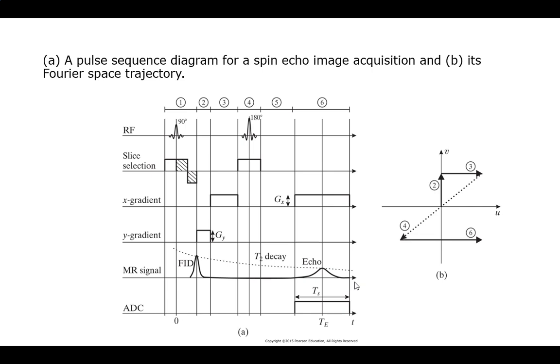So instead of taking advantage of this, I'm now going to position myself so I can do my echo measurement. I perturb Y in the opposite direction I want to go. So it goes up because I want to go down. And then I perturb X, so I am now in the complete 180 opposite through the center. I need that mirror through the center symmetry. It is now set up, right, at this point, so you can now do your 180 kick.